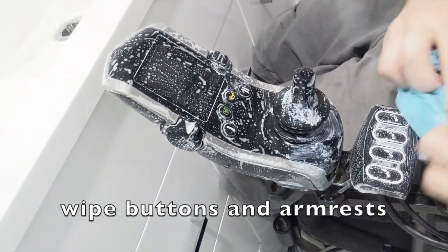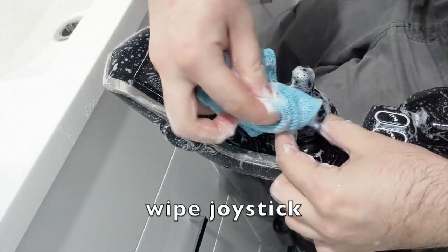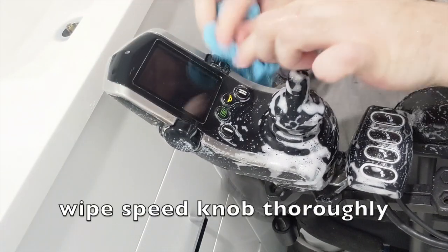Wipe the buttons and armrests. Wipe the joystick. Gently wipe the display. Wipe the speed knob thoroughly.